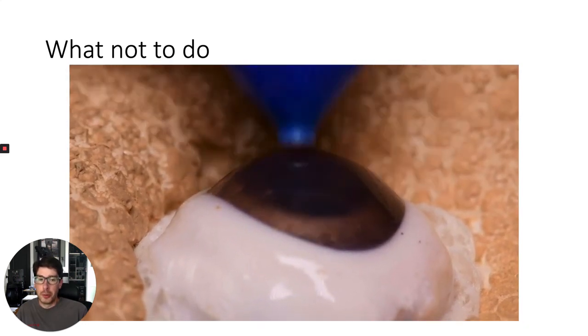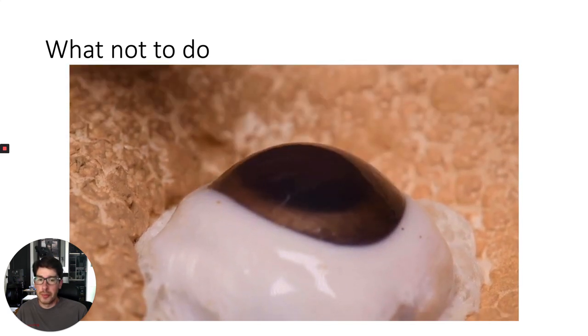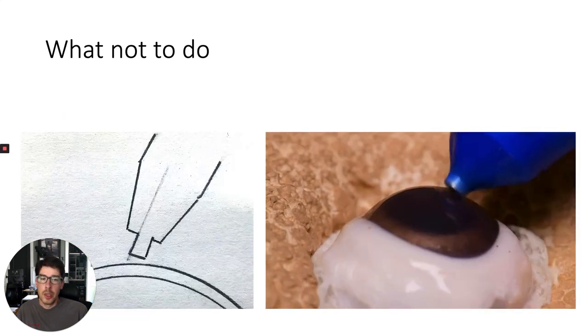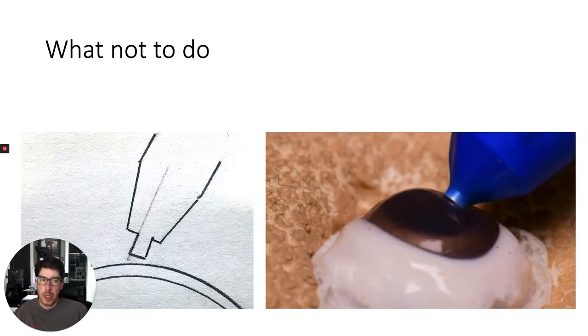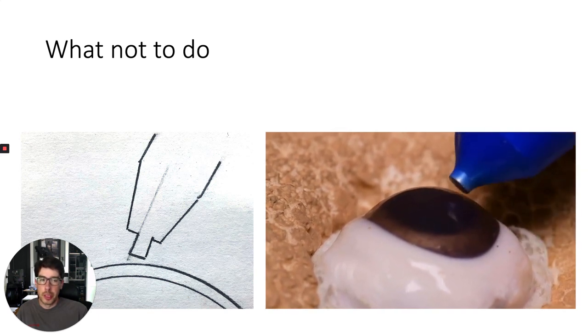Apply directly over the pupil. Although it's tempting to check measurements around the perimeter of the cornea or even over the sclera, doing so will lead to useless readings. Make sure you're presenting the probe perpendicular to the surface of the cornea. Angling the probe will prevent the entire probe from contacting the cornea and prevent a measurement.